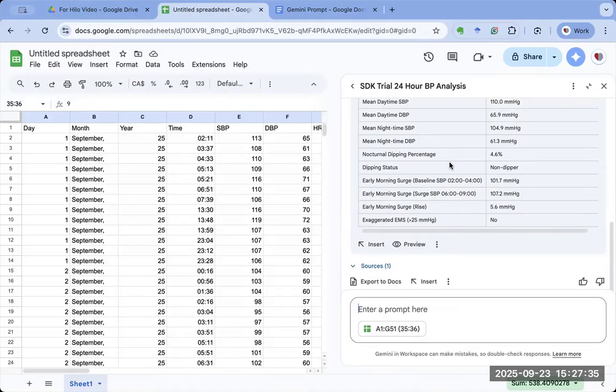For some people, it could be an indication of obstructive sleep apnea. Then this flags something when I would tell you that you need to be checked for sleep. You need to get a sleep study done. Sleep apnea is when someone stops breathing at night, and having obstructive sleep apnea that is not corrected can raise risk for heart disease, stroke, and dementia, and mood disorders as well.